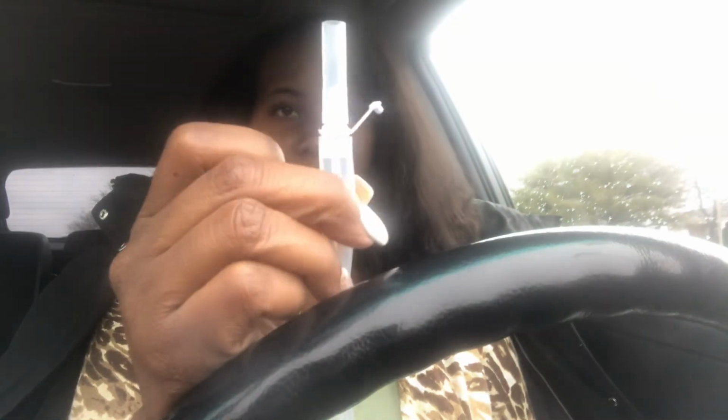Now mind you, this is not the original Freemie tube. I highly suggest, if you get replacement tubes, that you get it directly from Freemie. Do not get the knockoffs. These tubes annoy me so much. It's awkwardly shaped. It falls out of the pump so much easier than the original tubing, which is probably the reason why I really stopped using this pump as much, because I had to replace my tube. My first one got damaged. So I will be buying the proper tube soon, because this ain't it.